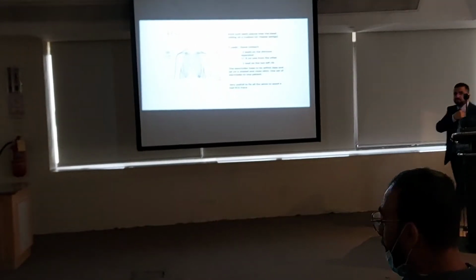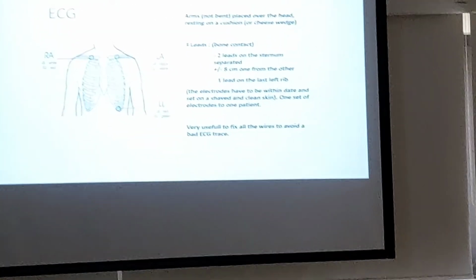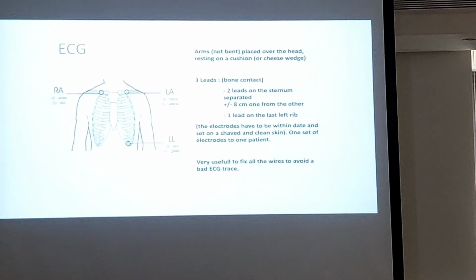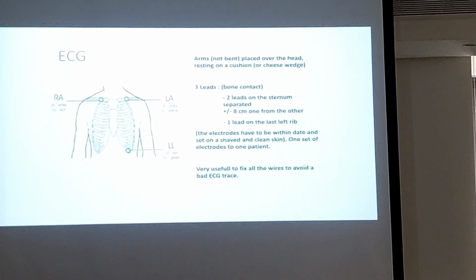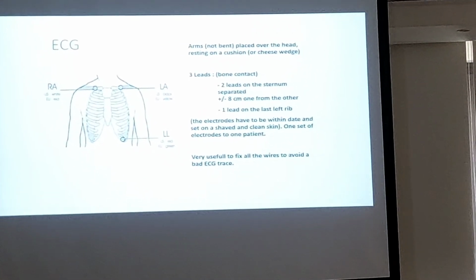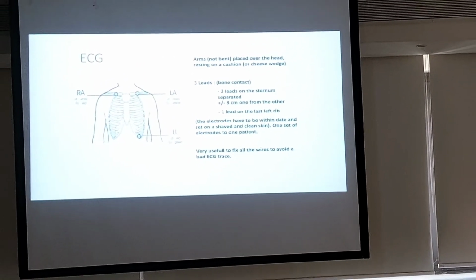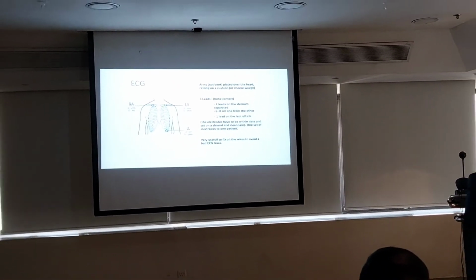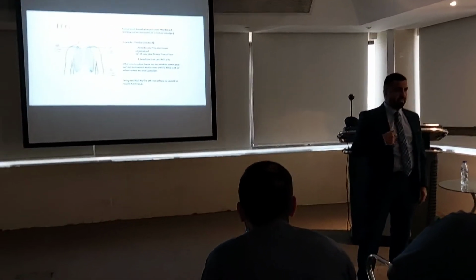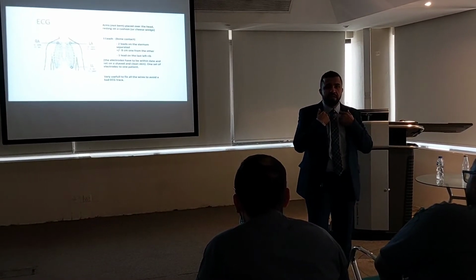Now this is the position of the leads. You will fix it with the right arm, left leg, if you have 3 leads. And nowadays with the machines we have 4, but still it is using the better 3. Make sure you are not positioning it on a scar of the skin, and make sure you are a little bit away from muscles. The best position on the skin is at the mid-clavicle level.